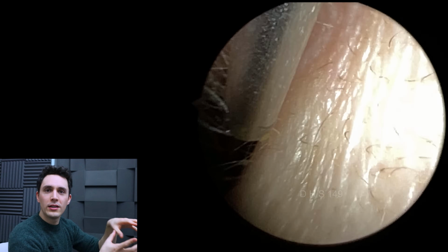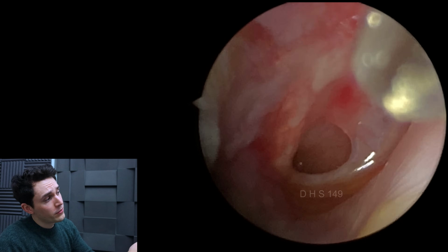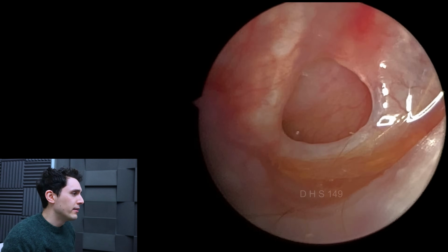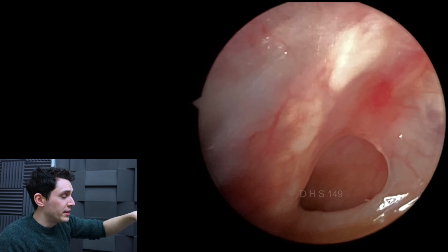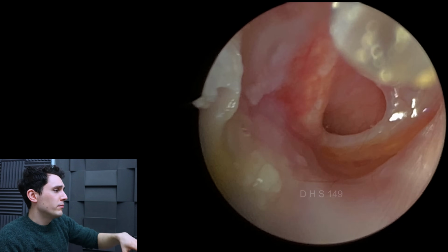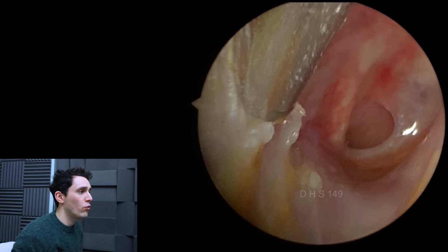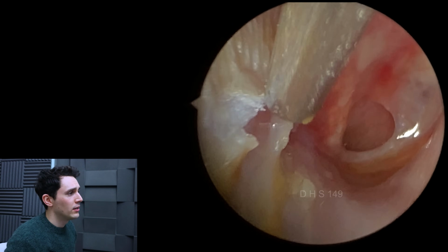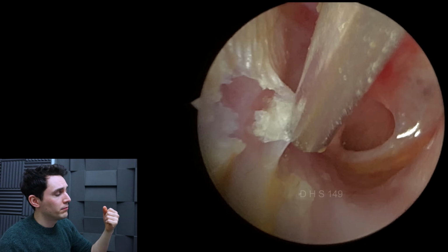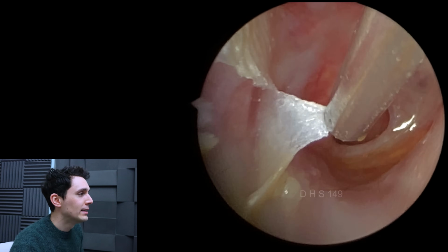And that's kind of what we're seeing here. We're seeing this mucousy discharge because there's a perf in the eardrum. You can clearly see it there. And that's what all this shiny discharge is. So, eardrum, very inflamed. Again, vasodilation, one of the hallmarks of infection, the other hallmarks being pain, heat, swelling, dysfunction, and so on.